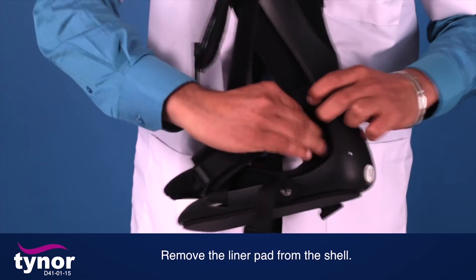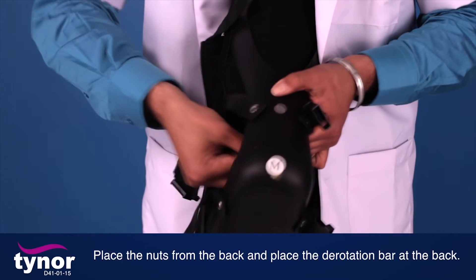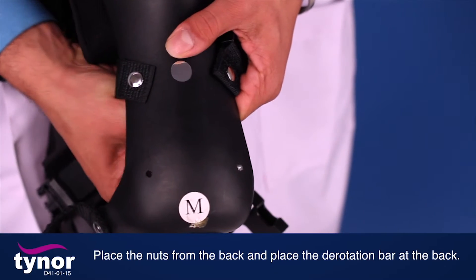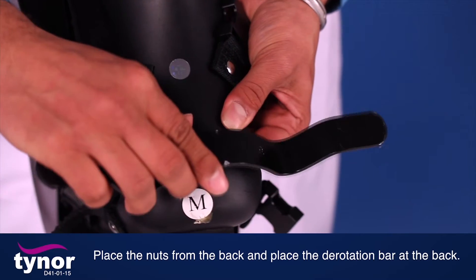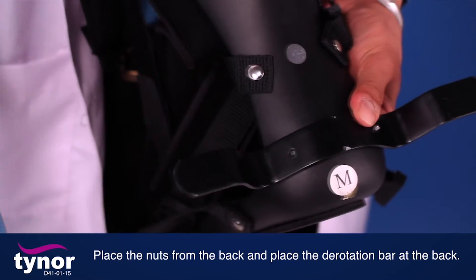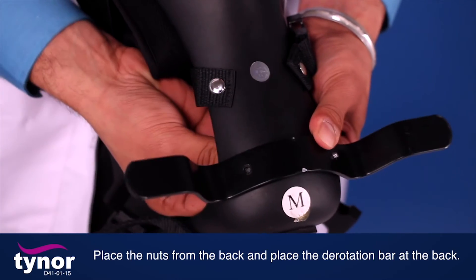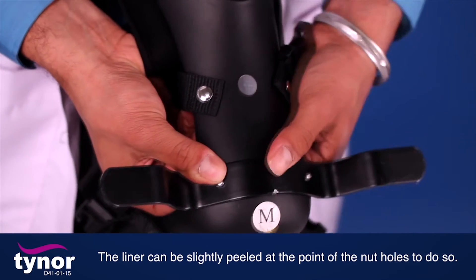Remove the liner pad from the shell. Place the nuts from the back and place the derotation bar at the back. The liner can be slightly peeled at the point of the nut holes to do so.